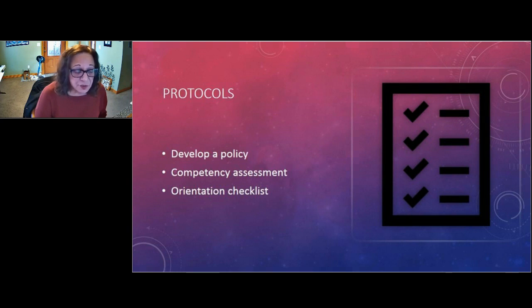It lists everything that should be done in your facility, in your dental practice. And I would make it very brand specific, chemical specific, so that if I'm a new employee, I can read that policy and procedure and get a really good idea of how long the item has to soak, how long the chemical is good for, and how to do the testing.